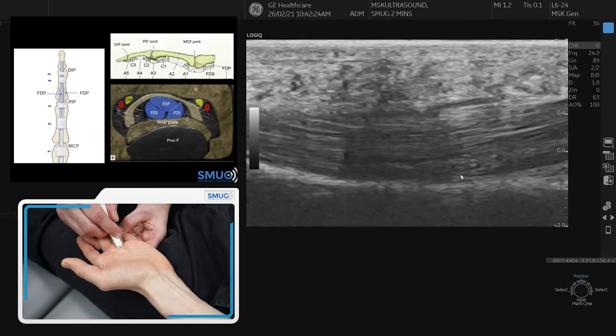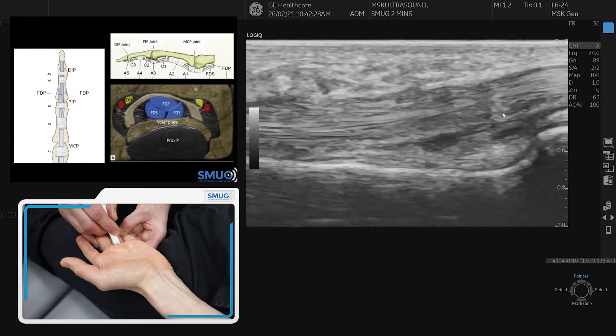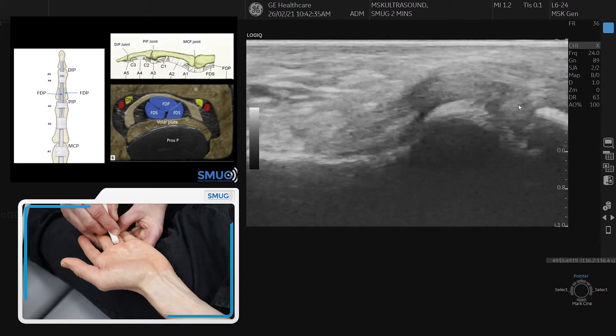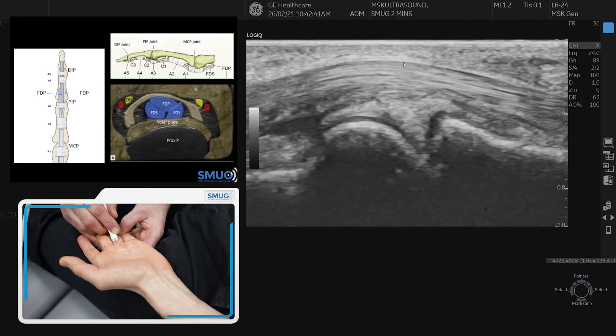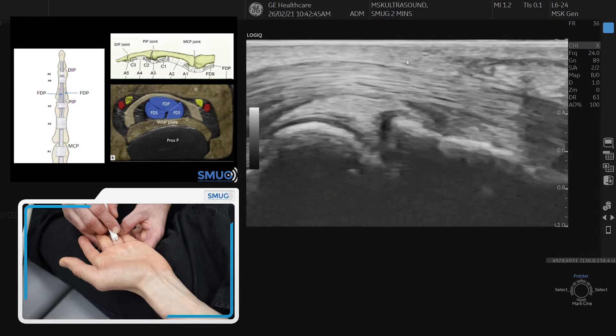Then we go to the next joint. Do pay attention to the volar plate, which is underneath the tendon at the joint level. Again there's a pulley on top — quite thin, you have to look for it carefully. That's the third pulley, and then we're going to go further.